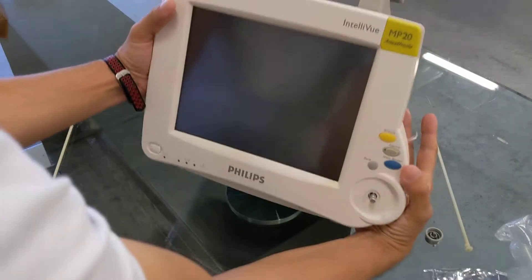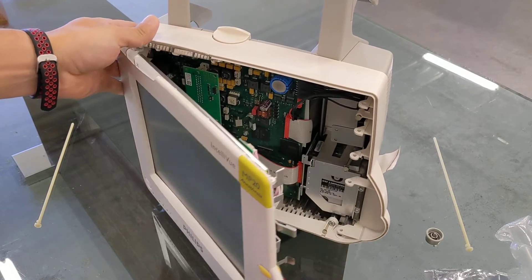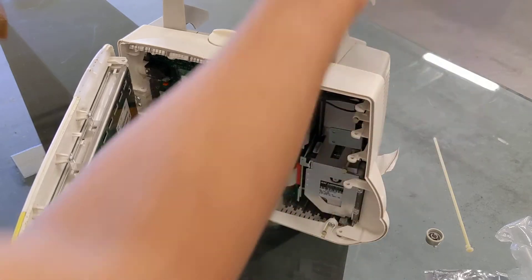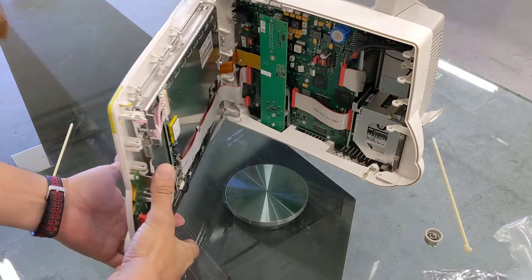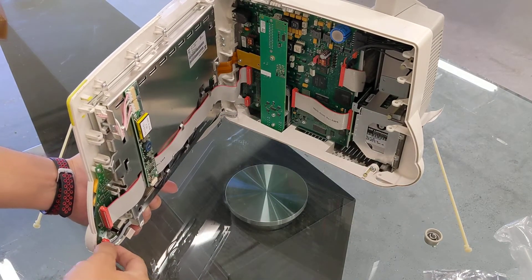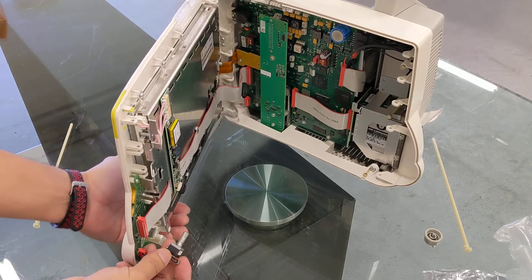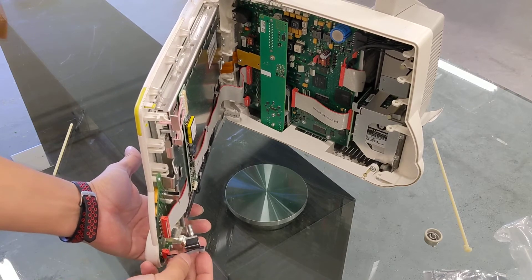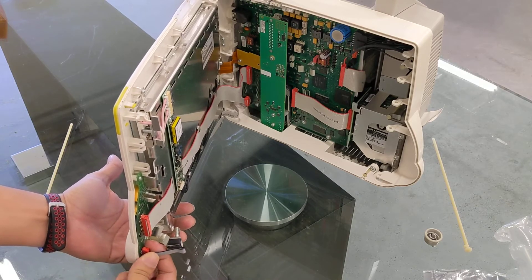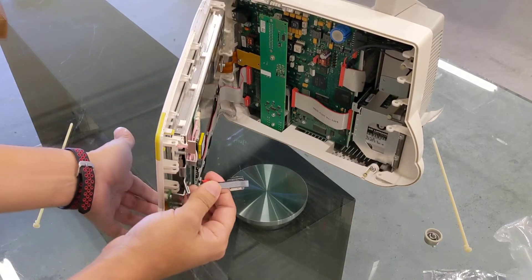Stand up the machine and the screen comes out to the left. Once it's open, be very careful — these little flex cables on this side can break. We just want to disconnect this part: pull it out of its socket, and be very gentle when unclipping it. It comes out like so.